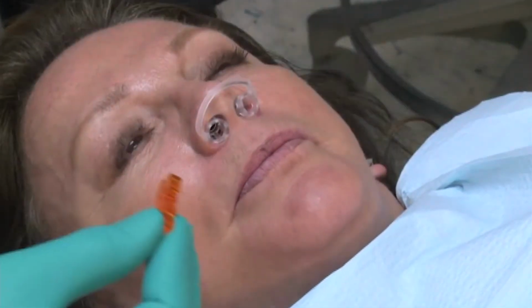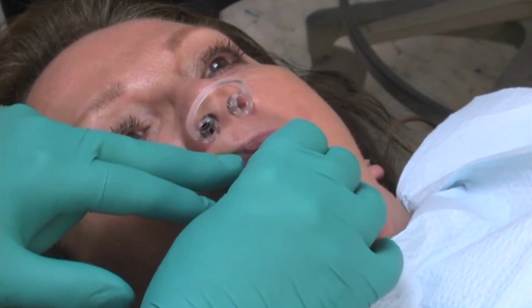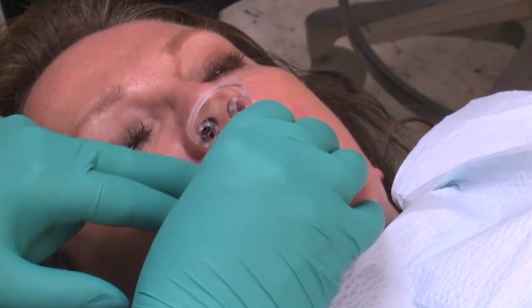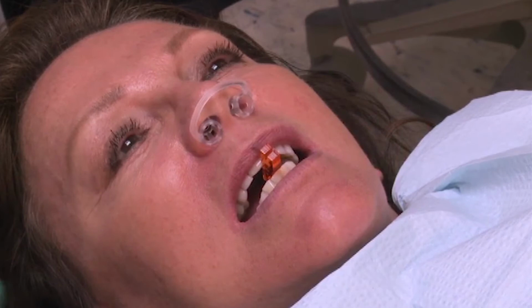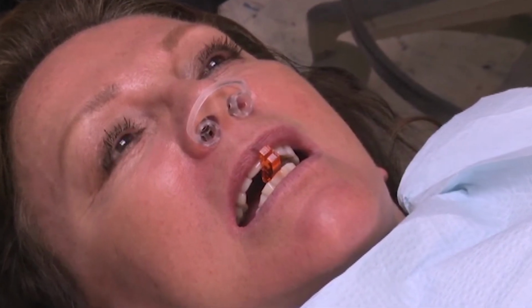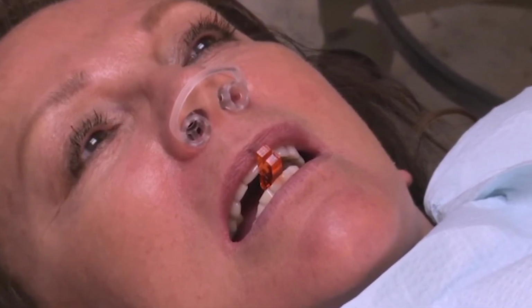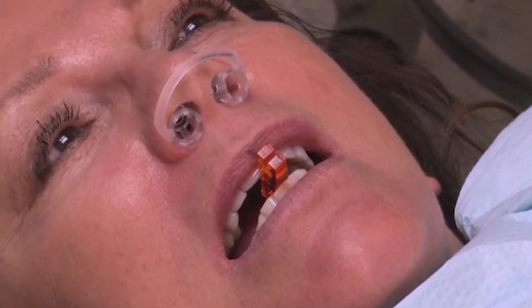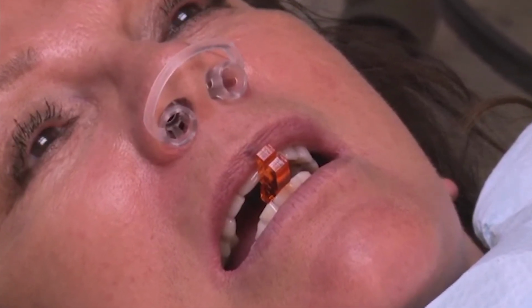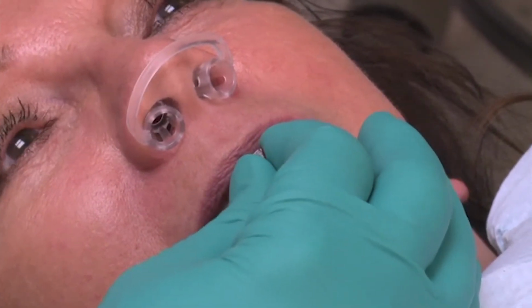So Kim still has our nose cones in. Let's position our key, middle notch, close into that notch, Kim? Now, for video purposes, I'm going to let go of the key. I advise you not to do that. Keep control of the key, because we're going to have her snore and inspire, and the last thing you want to do is have your patient aspirate that key. So I'm going to go back and hold it. Go ahead and try it now, Kim.